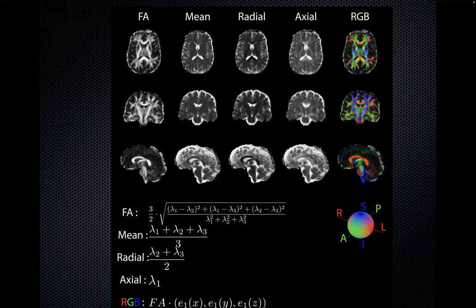It's easier for water molecule. Now the axons are, there's less axons and maybe they're aging, these axons. So there is more water in the axial diffusivity direction and more water in the radial diffusivity. Right? It's easier for the water molecule to bounce left, right here.